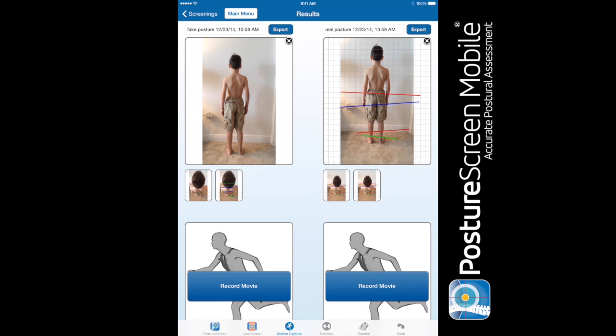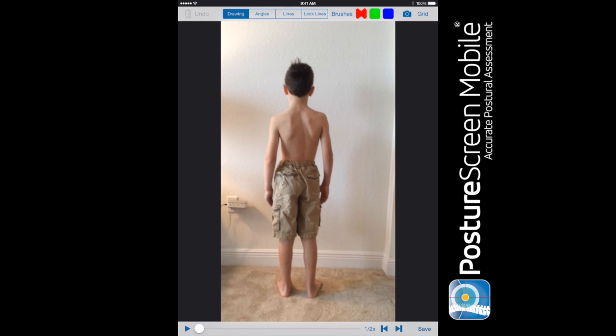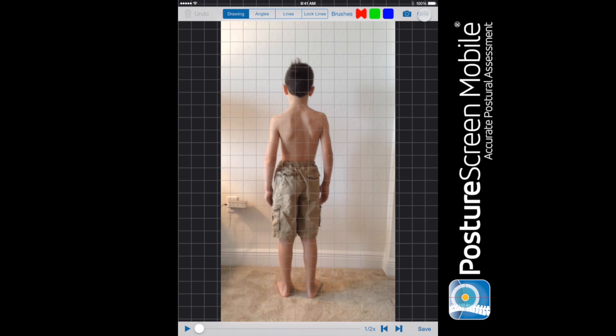But we can also do above down, and the way we do this is using the motion capture. So we can create a video and I'm going to go ahead and put a grid line on here.